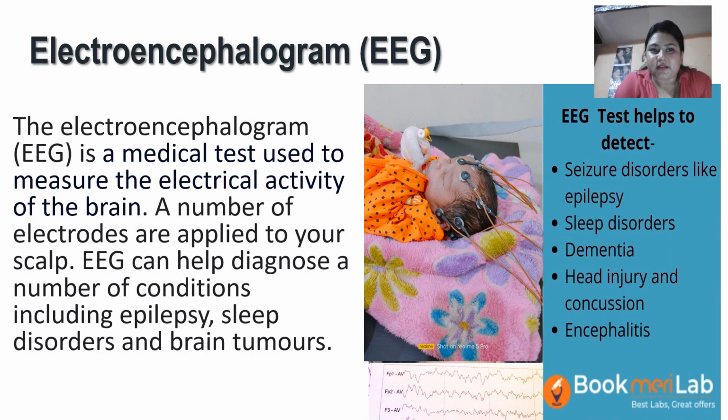Electroencephalogram, EEG. The electroencephalogram, EEG, is a medical test used to measure the electrical activity of the brain. A number of electrodes are applied to your scalp. EEG can help diagnose a number of conditions including epilepsy, sleep disorders, and brain tumors.